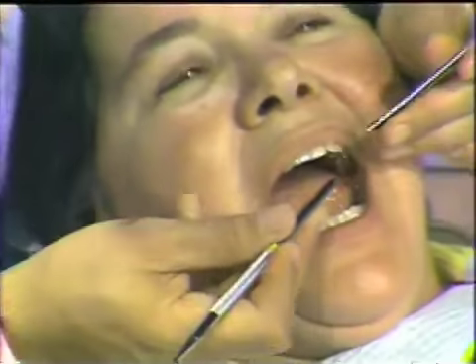Now, looking at the patient, the vitalometer recordings and, as I said, percussion recordings should be made as they are routinely. The periodontal examination should be made, which is done routinely. And I'd like to show the way in which the mobility of the teeth should be recorded.